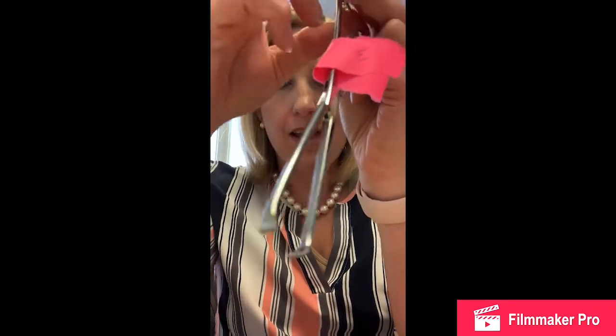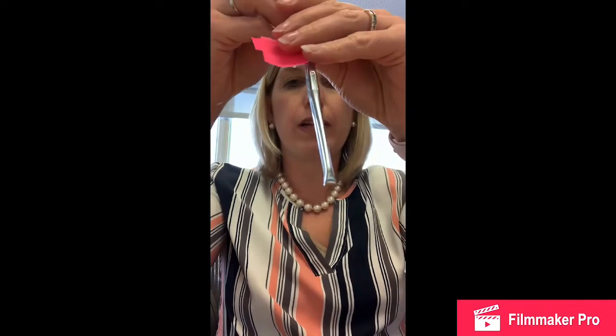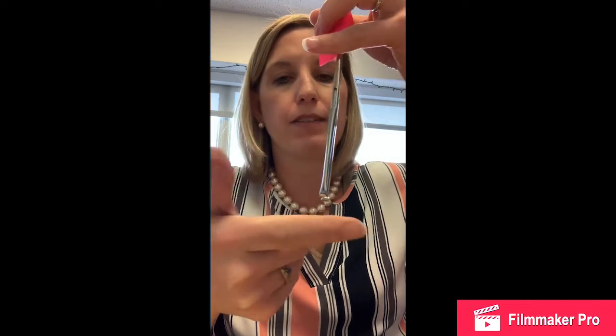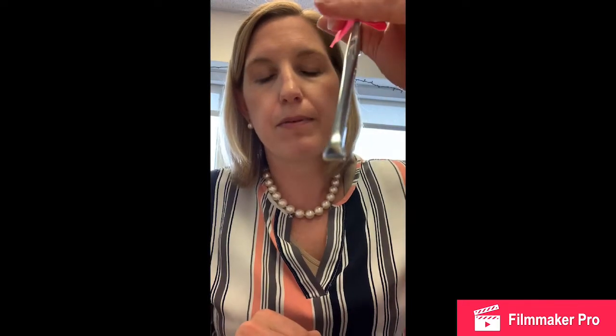As you can see, this Allis doesn't have the openings on the end like that, and also has kind of serrated tips here. This is not as gentle of a clamp. I typically will use this in bowel anastomosis when we're holding up an end that we know is going to be cut off. So you'll notice that we'll ask for many Allis clamps in a row to hold up a section. Again, this is not as gentle as the Babcock because of the serrated and grippy edges here, but this is an Allis clamp.